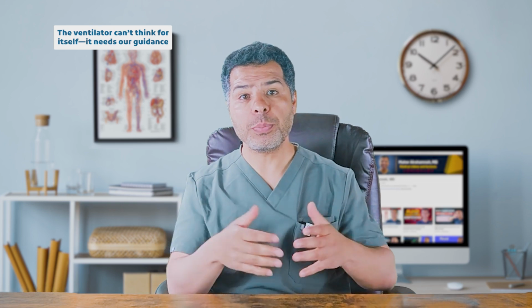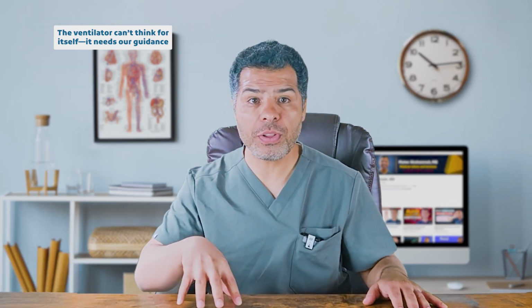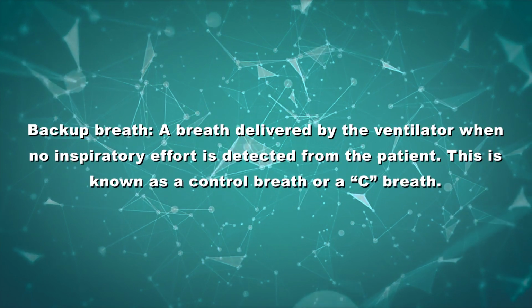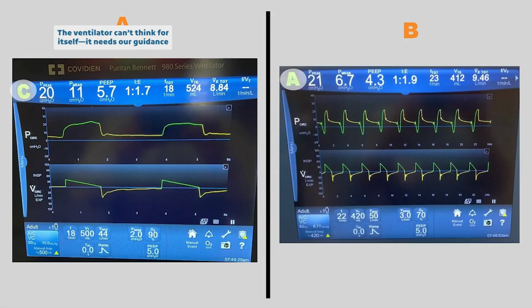Let's say the patient is paralyzed or brain dead. In this case, the ventilator has a built-in safety mechanism. It will deliver a breath if no patient trigger is detected for a specific period of time. This is called a backup breath, or as we call it in mechanical ventilation, a controlled breath or C breath. Take a look at these two ventilator screens. The breath in picture A is a controlled breath or backup breath, labeled as C breath, and the breath in picture B is an assist breath that was triggered by the patient and assisted by the ventilator. You see the A letter.